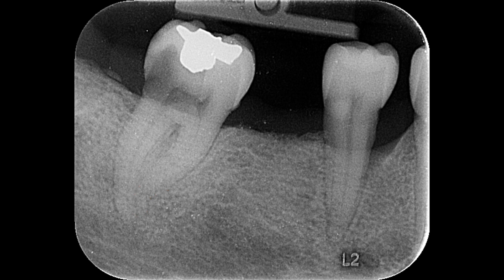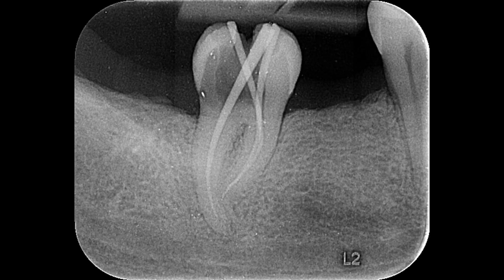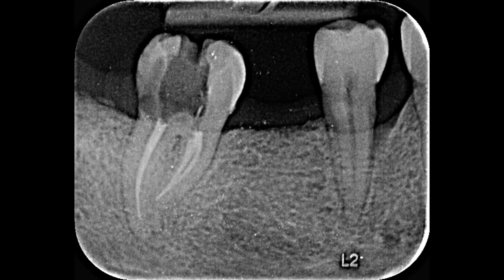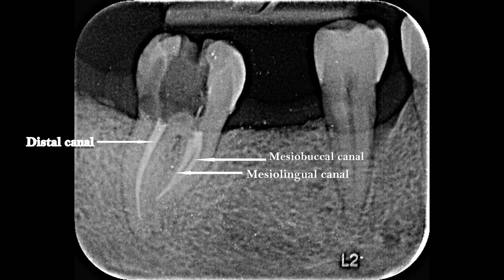After locating and preparing all three canals, let's see the working length radiograph. All three canals look very well prepared and shaped with good taper. And this is the final radiograph where you can see the three well-obturated canals — this is the mesial buccal canal, this is the mesial lingual canal, and this is the distal canal.